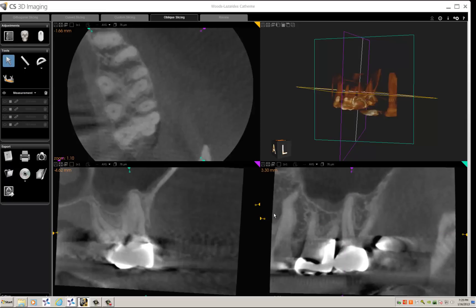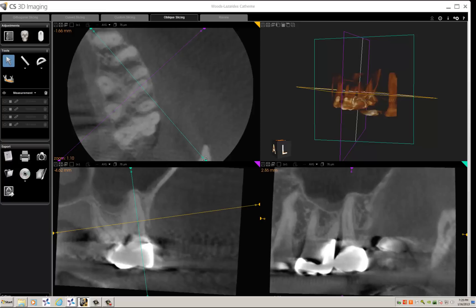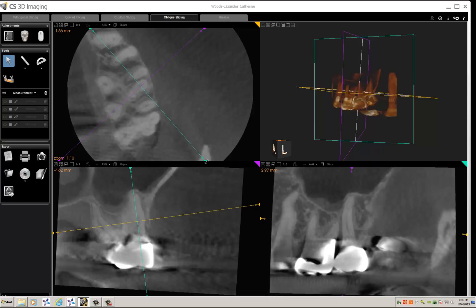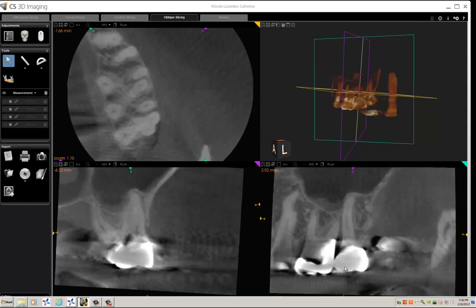Now you're actually ready to position your slices so that you get an accurate orientation of the root. We'll look at the mesial buccal root first. Here is the mesial buccal canal — I will orient it right over that canal with both the sagittal and coronal views squarely right on the root. This will give me an accurate measurement of the mesial buccal root.